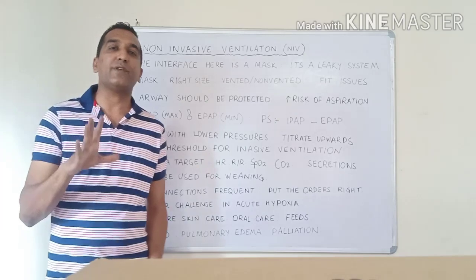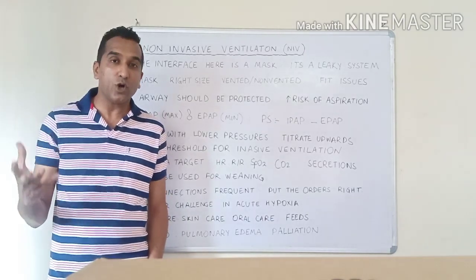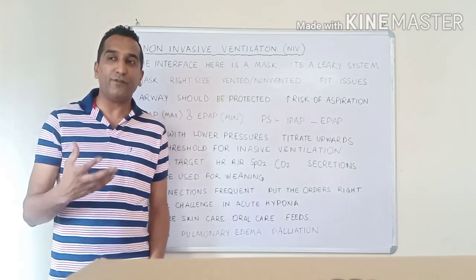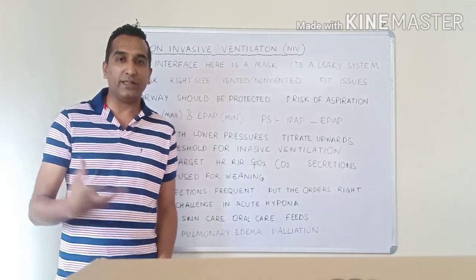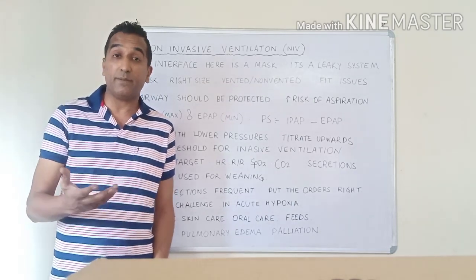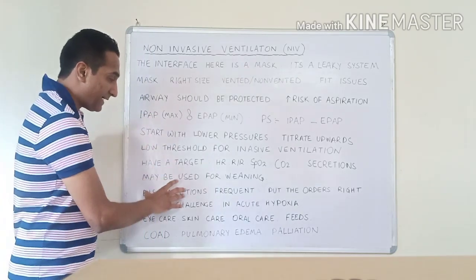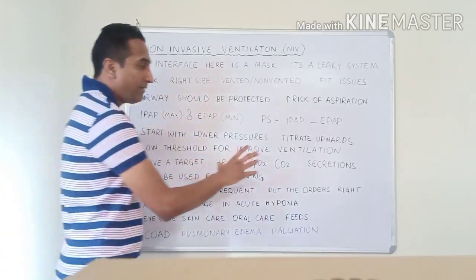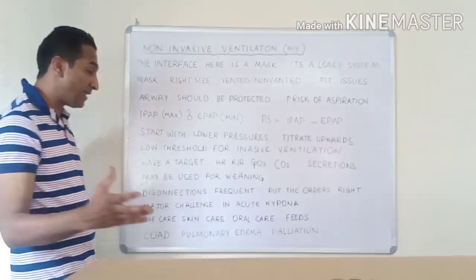This should be well recorded, because disconnections of 1 to 2 hours are also not uncommon, and we generally do them when we feed them, because as I told you, the stomach is now full with food, and then you put NIV, a lot of air goes in, patients feel a lot of discomfort and they might vomit. So you should know if I can disconnect and put it right on the papers, how much time you disconnected and what happened.